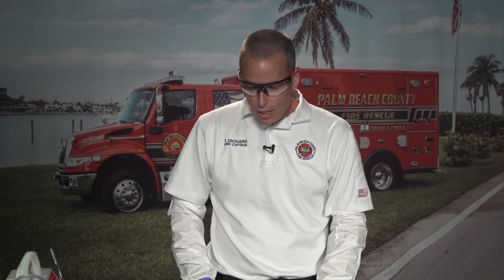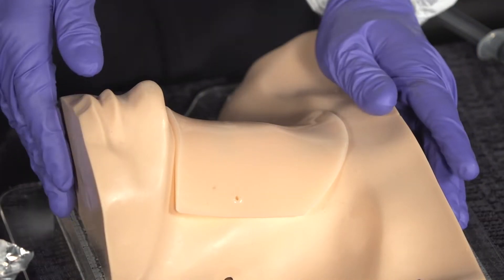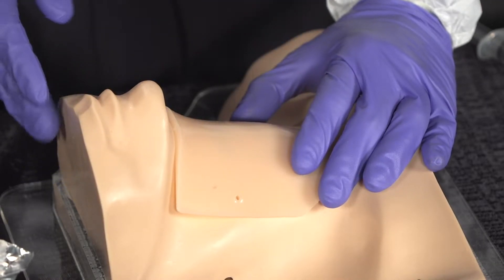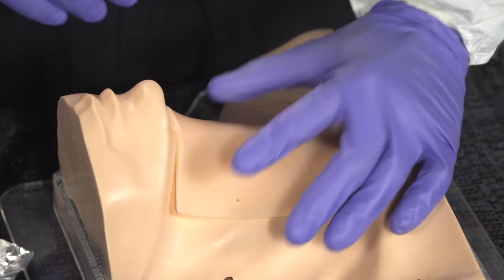Once you've decided to perform a surgical cricothyroidomy, the procedure should move fairly quickly. I recommend having an assistant — more than one person if possible — as this should be a two-person job. Once ready, ensure the patient is properly positioned, all equipment is assembled including suction, and identify your landmarks.